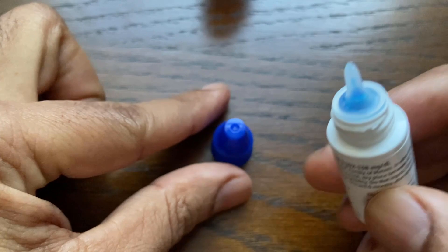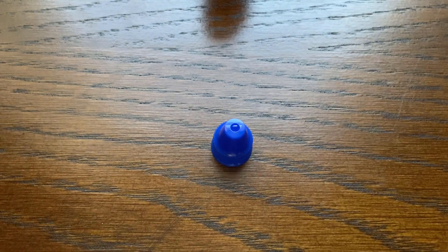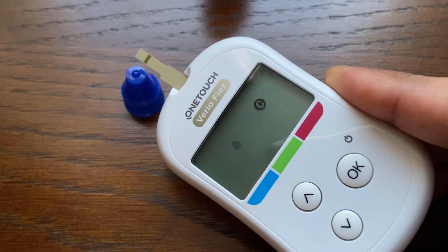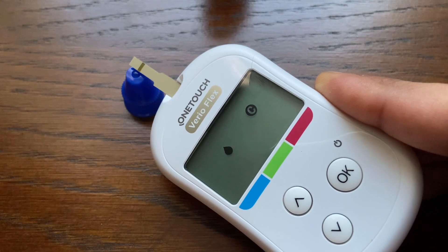Next, squeeze a drop into the small well on the top of the cap or onto another clean non-absorbent surface. Touch the channel on the side of the test strip to the control solution and wait for the channel to fill completely.